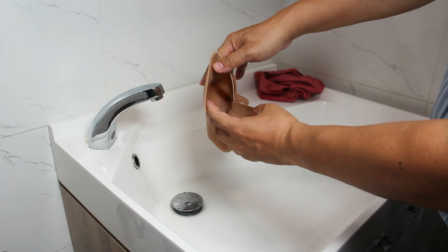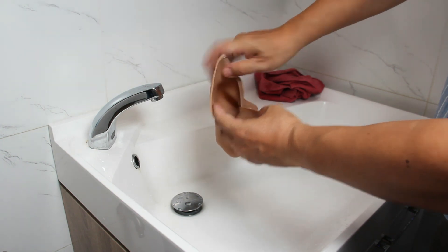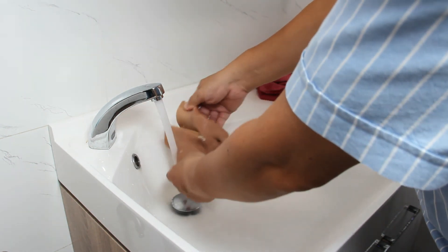If it is silicone or foam-and-silicone filling, there is no need to worry about the filling, as silicone is waterproof. The prosthesis can be washed inside and out.